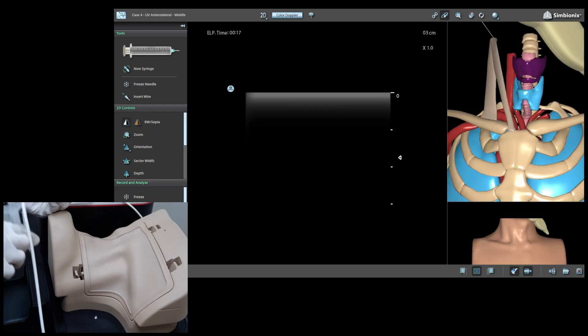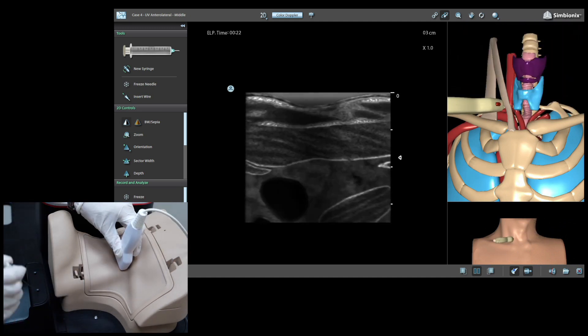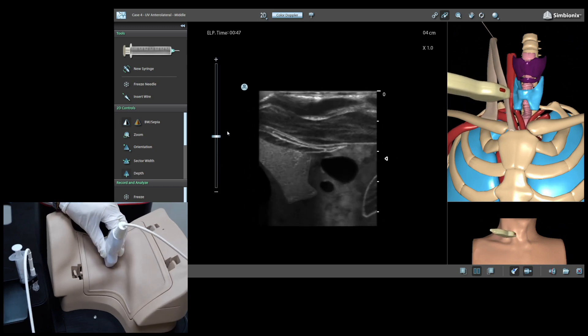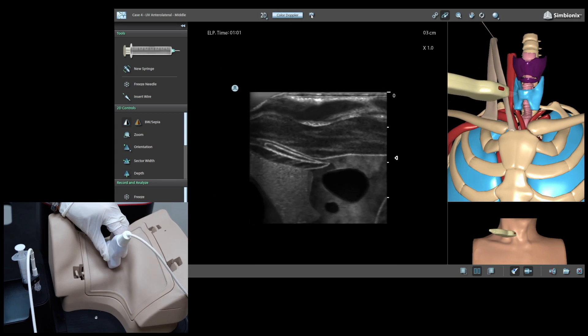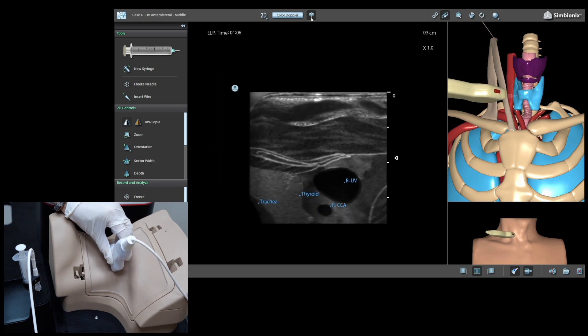Let's start with ultrasound assessment to identify the vessel's location. Evaluation of the depth and adjustment of the ultrasound image. Anatomical labels help the trainee better identify the different anatomy structures.